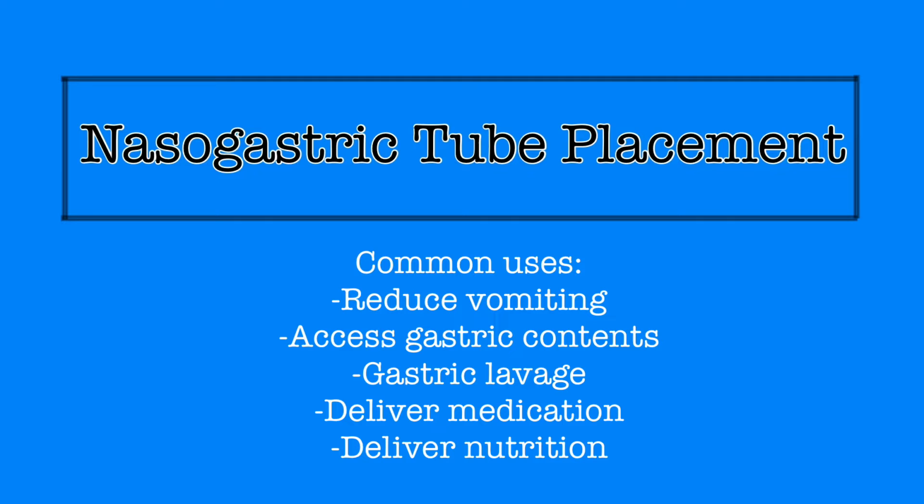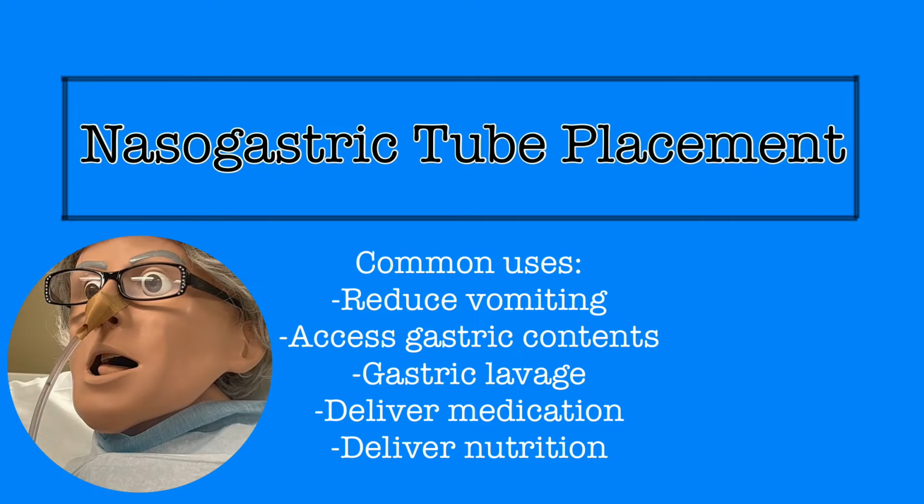The process of placing an NG tube can be demonstrated on a manikin, and in this video, the steps of placement will be explained and demonstrated this way. Knowing the steps will get you most of the way there.